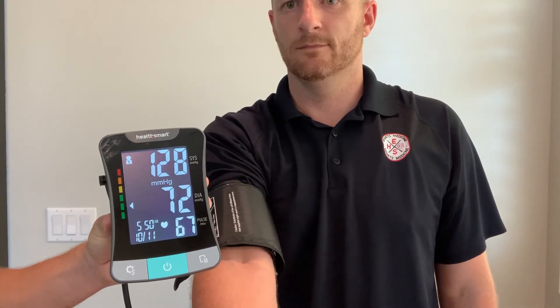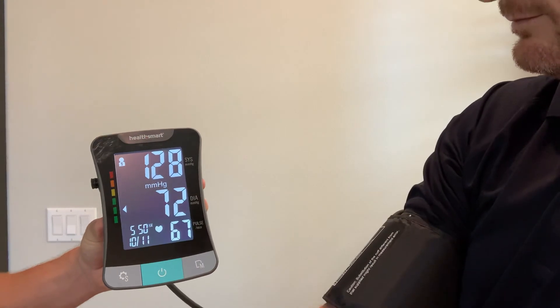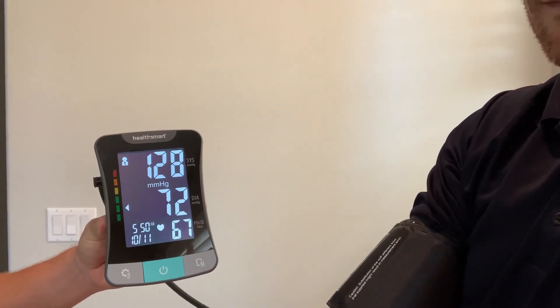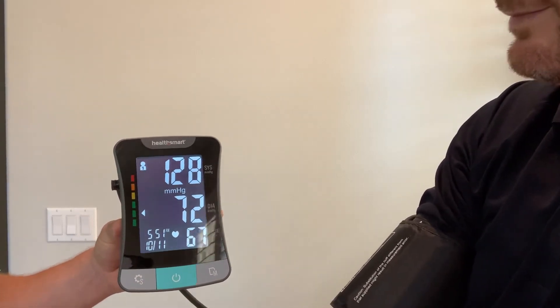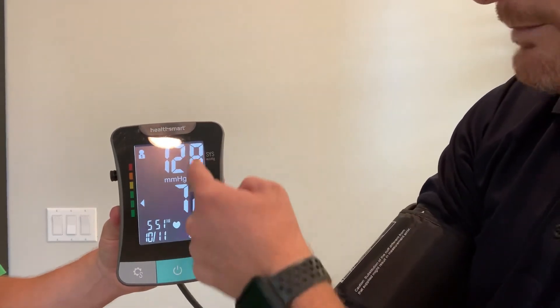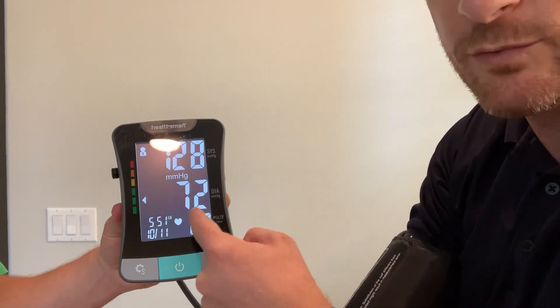Your systolic pressure is 128 mmHg, your diastolic pressure is 72 mmHg, and your heart rate is 67 beats per minute. As you can see, this shows my blood pressure which is 128 over 72, and my heart rate or pulse which is 67.